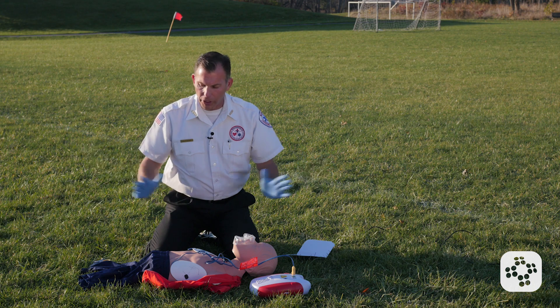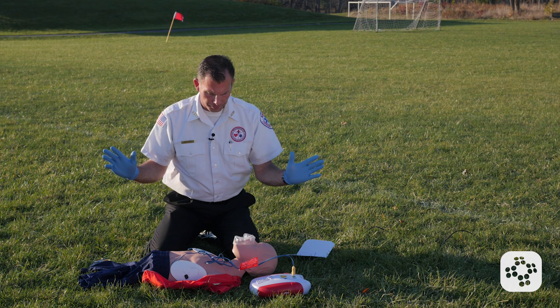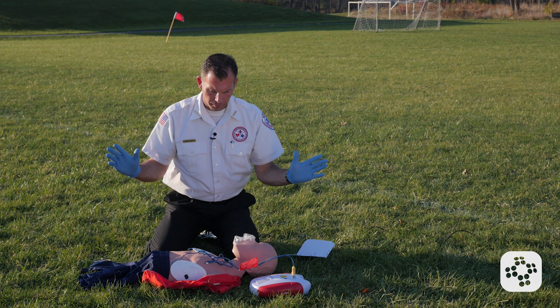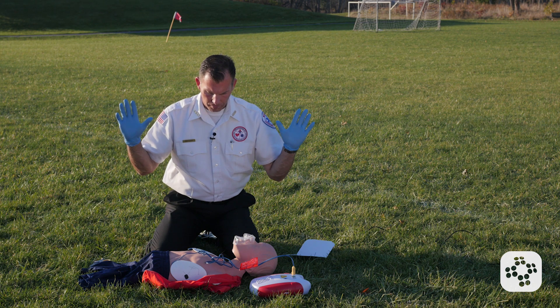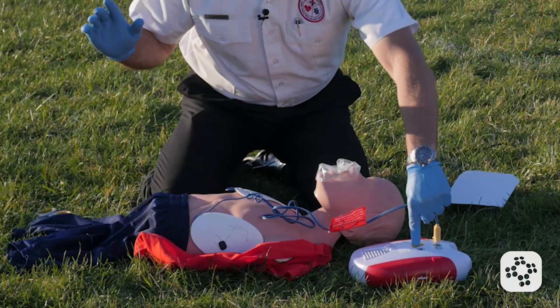Now I'm going to put the actual electrodes attached to the AED. I make sure that I'm not touching the patient and no one else is either. Shock advised. Charging. Everyone stand clear. Push the shock button. Shock delivered.